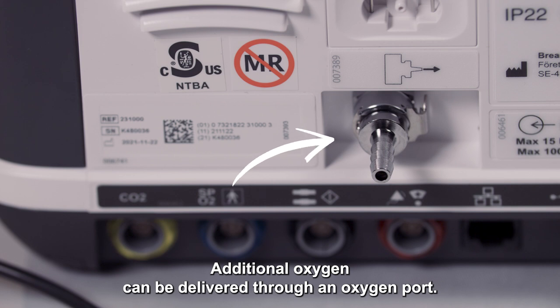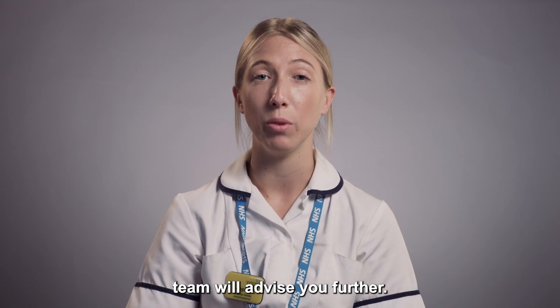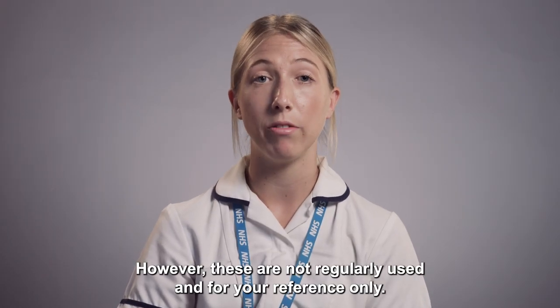Additional oxygen can be delivered through an oxygen port. If oxygen is required, the Home and IV team will advise you further. Additional accessories can be added to the device; however, these are not regularly used and are for your reference only.